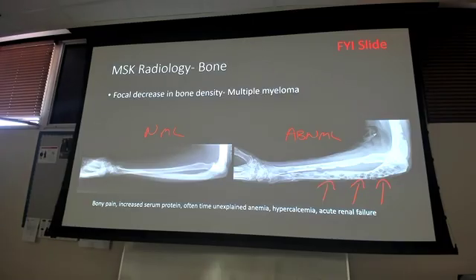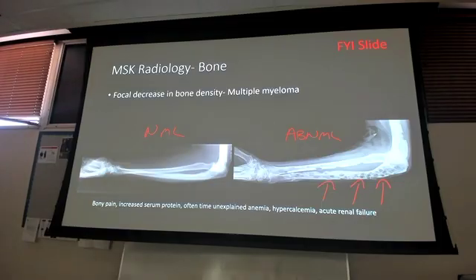Now, when we're talking CTs, which we'll get to, that's a lot more radiation. If we have a better study for certain age populations, we will, and we'll talk about that when we get there. But the best analogy I can give is that a chest X-ray is two pictures, right? Everybody in this room gets more radiation exposure from a single round trip flight anywhere in the country than you get from a chest X-ray, due to being up in the thin air, closer to the sun. So it's minuscule amounts when it comes to regular X-ray.